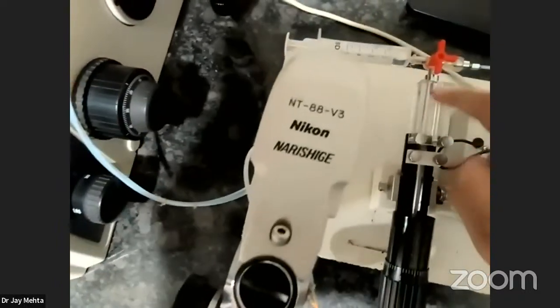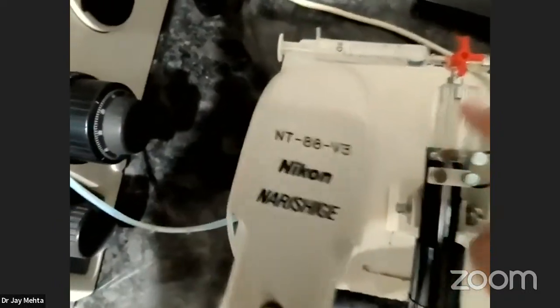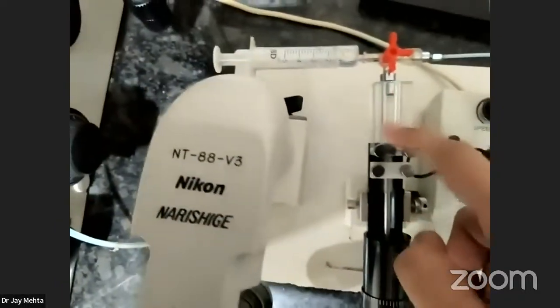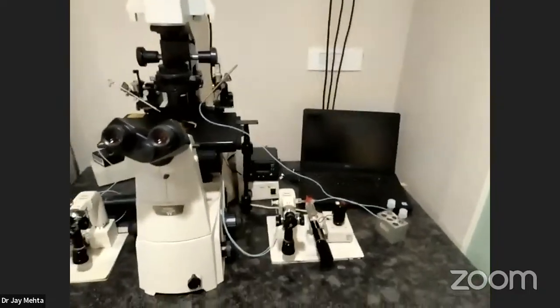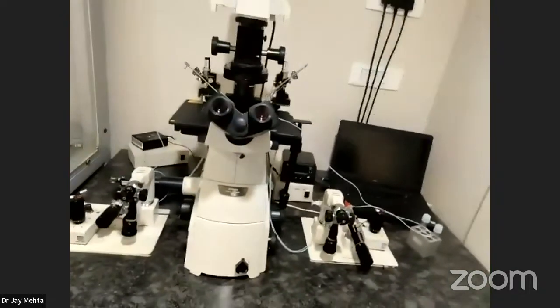This is your pneumatic suction. Can you see this? This is your holding pipette, pneumatic suction. Okay, it is oil-based suction. Quite a lot of times there is a bubble going inside this. People don't know how to correct it. When people don't know how to correct it, then there is a big problem. Automatically, you are dependent on the service engineer to come and do it for you, right?